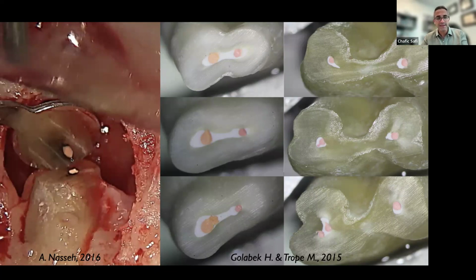This is this black line around the gutta-percha cone. And this gutta-percha cone is just floating inside the root canal system without any role. It's not sealing, it's not in interaction with anything, it's just there doing nothing. And this is what's happening with a lot of our traditional sealers: we're losing the sealing of the tooth, and thus we are contributing somehow, the tooth is becoming prone to microbial leakage.